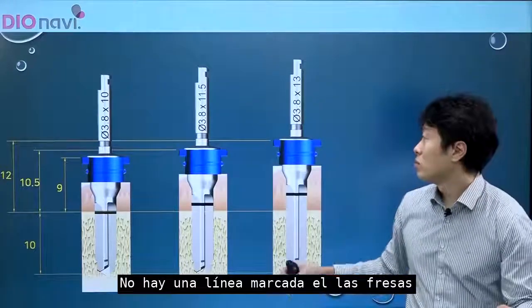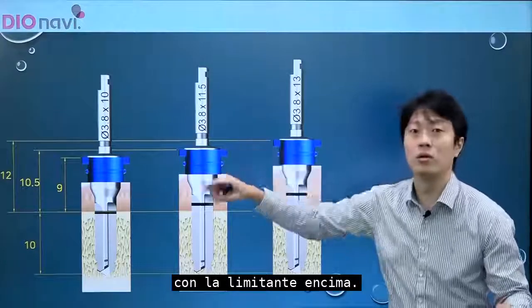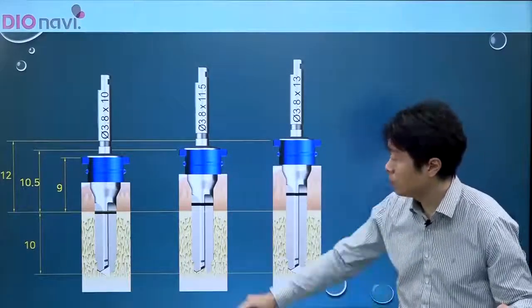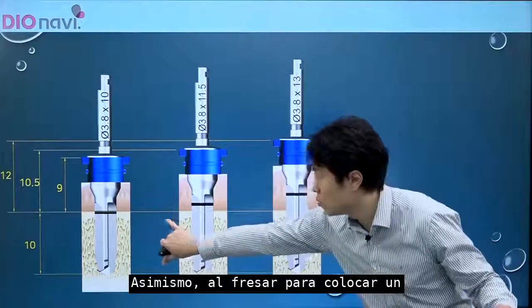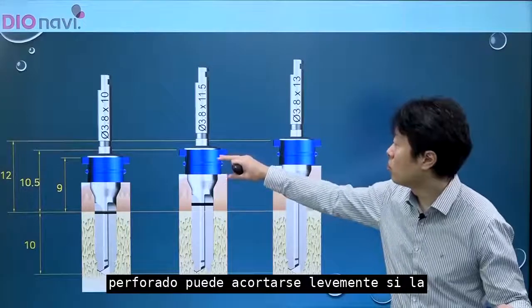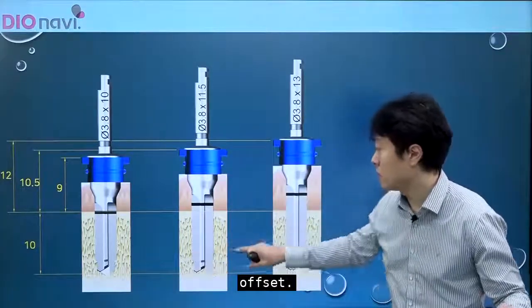There's no line marked on final drills. With the stopper on top, you need to adjust the length of the drill in this case. When drilling to place an implant of 10 millimeter, likewise, the length that has been drilled may come slightly short if the drill is not extended because of the offset increase.